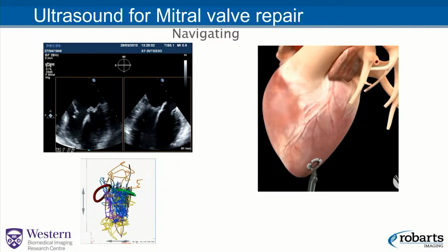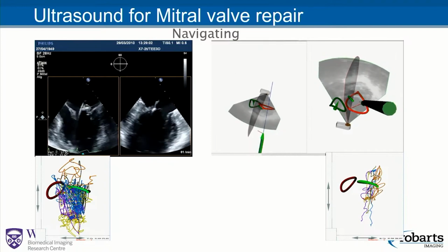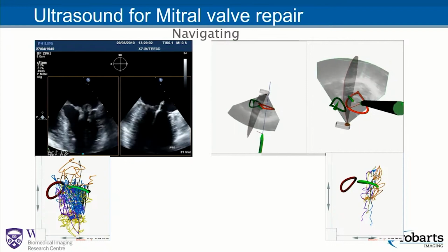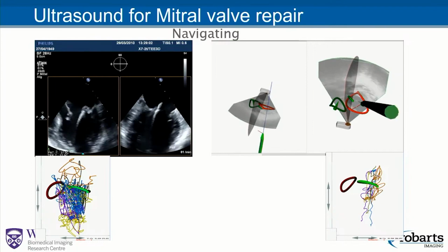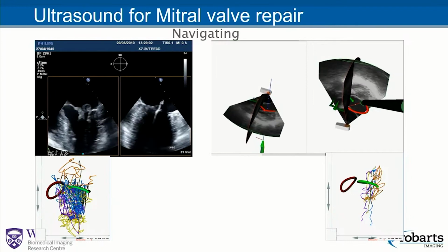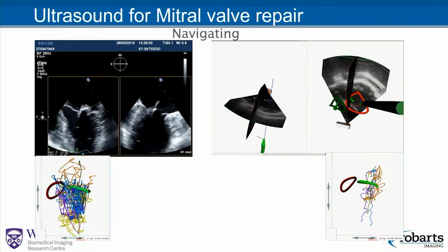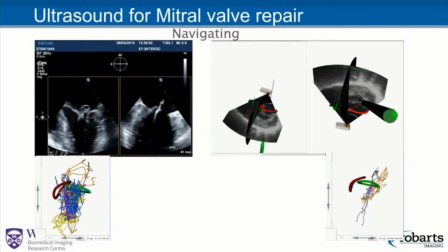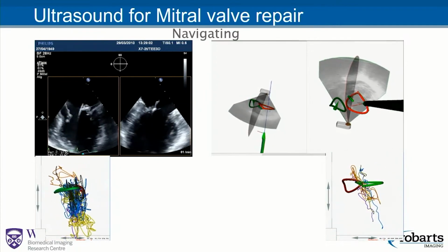So this led us to take a new approach where we integrated ultrasound and augmented reality. We built a system using the same imaging data, but using the display that we see on the right, where we can track the instrument both in terms of how far away it is from the target and how far off center it is from the target. And when we tracked the trajectories of all of the same surgeons, we got trajectories that look like the image that you see on the bottom right.